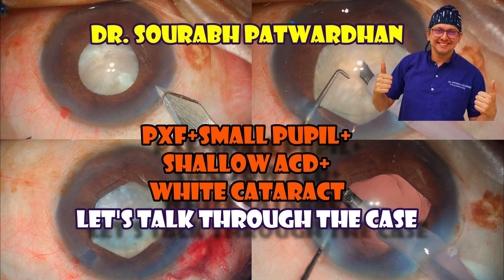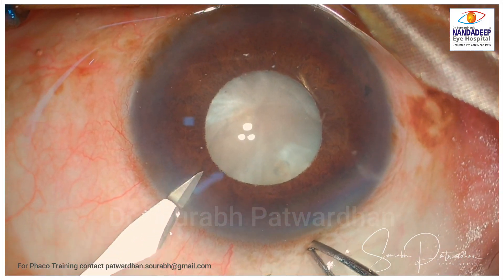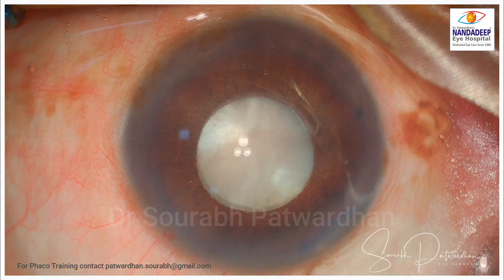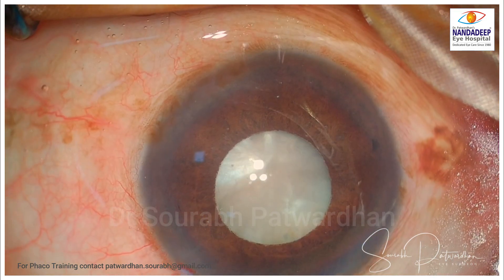Hello friends, I am Dr. Saurapatwadhan from Nanda Deep Eye Hospital, FICO SICS Training Centre, and in this video I am going to demonstrate a case of a mature cataract.